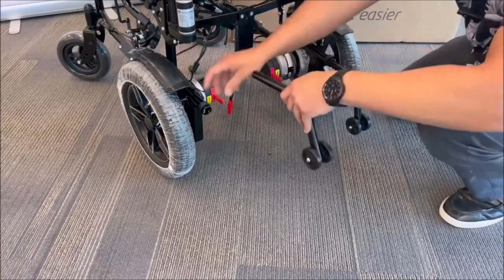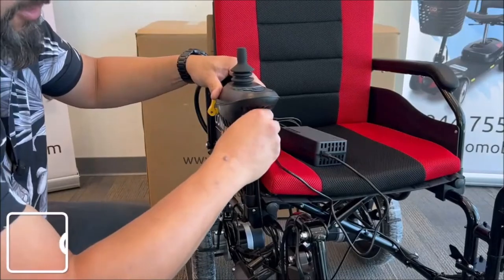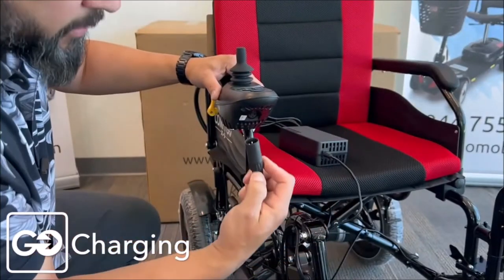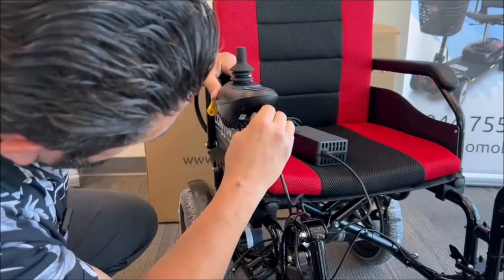Repeat that for the left side as well. Now if we want to charge our chair, we have to unplug this here. Here's our charger — it has three prongs, and the three prongs are going to be facing down with the third one on the bottom. Push that in just like that.